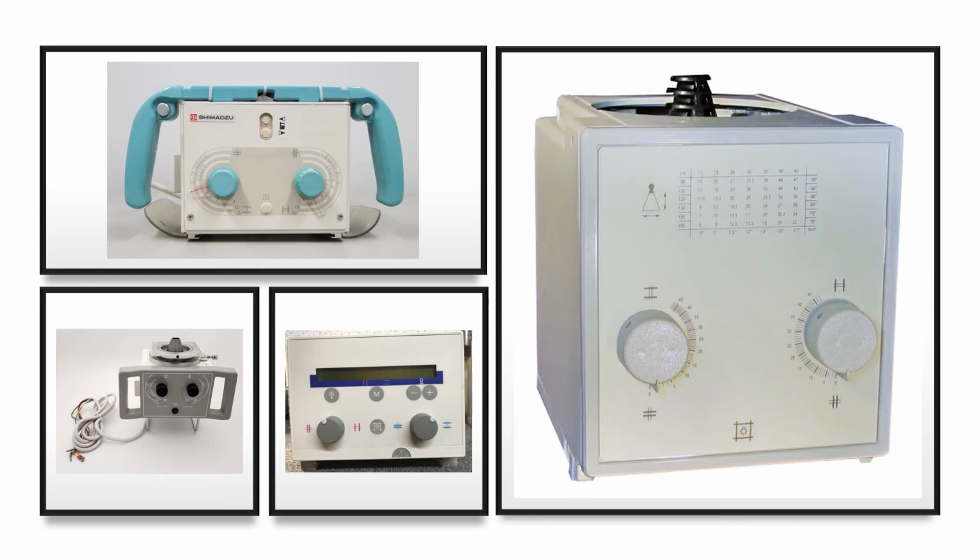As you adjust the dials, you are moving lead strips that are at least 3 millimeters thick inside the collimator housing. This helps you control the size of the X-ray field.